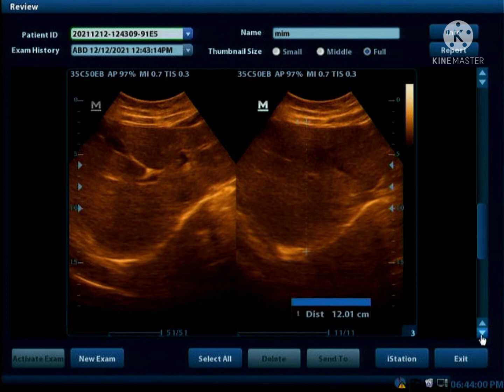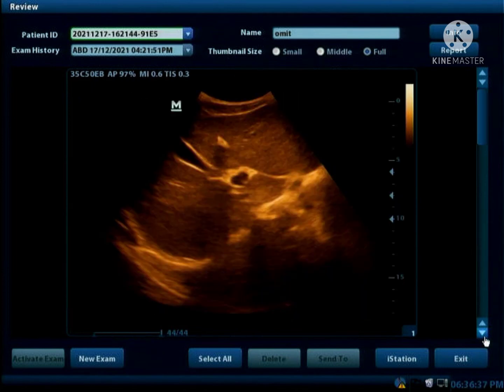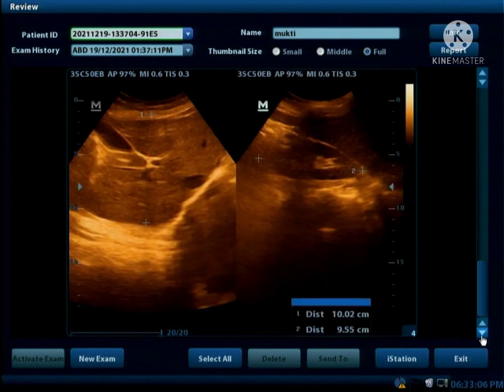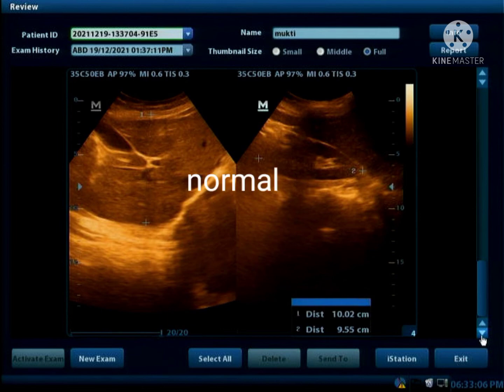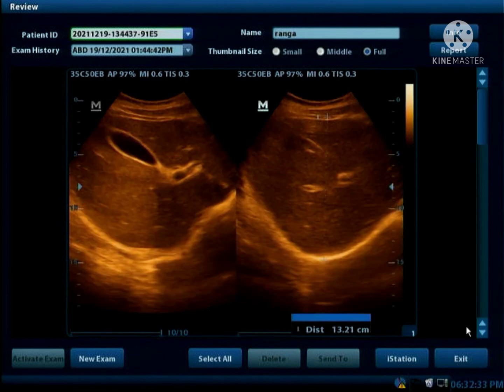This is almost a normal liver. This is also normal. Again, it's normal, and this is also normal.